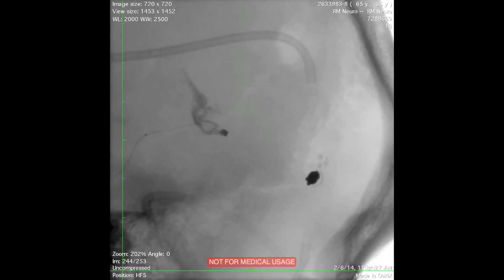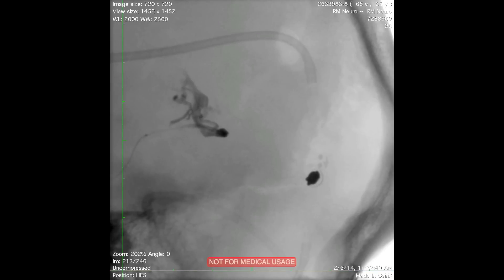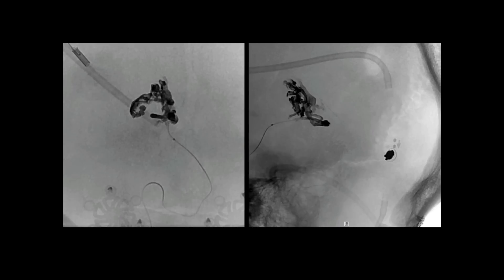An ONIX cast is obtained that conforms to the fistula pocket filling demonstrated during microcatheter injections. The embolization can continue over half an hour to sometimes as much as an hour to allow percolation into the correct fistula pocket. You can see ONIX getting into the accessory pockets associated with the fistula. This start-stop technique is used to allow the ONIX to polymerize and then find new pockets.